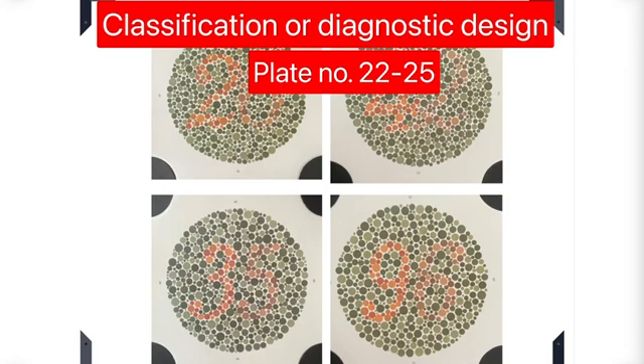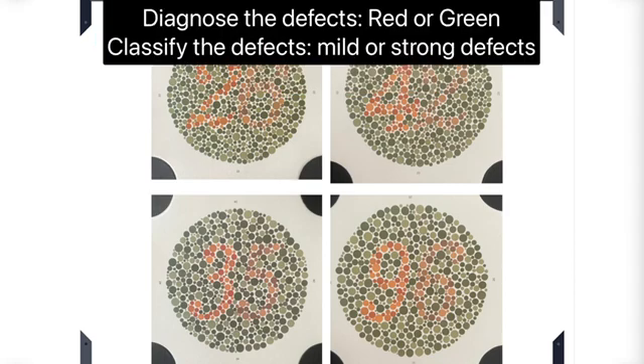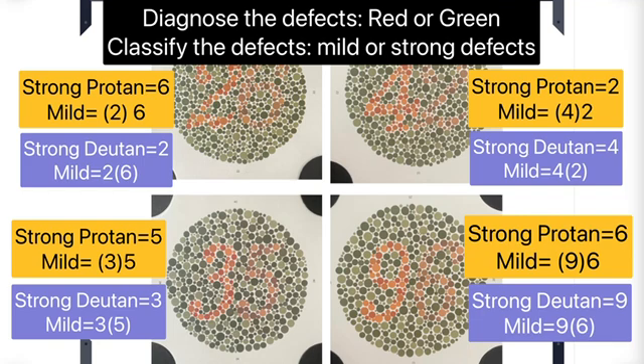Plates 22 to 25 are classification or diagnostic designs, which help in classifying mild or strong color vision defects and in diagnosing defects as red or green. For plate 22, which has the number 26 written on it: a strong protanopia (red defect) person will only see 6, while mild red defects will read both but 6 appears brighter. For strong deuteranopia (green defect), a person will see only 2, while mild green defects will see both but 2 appears sharper and 6 is confusing.